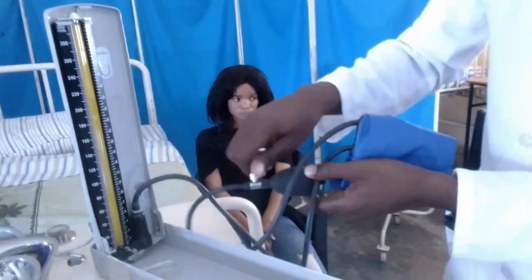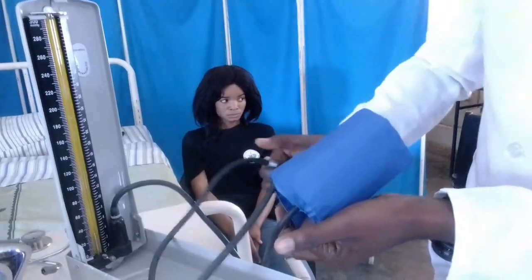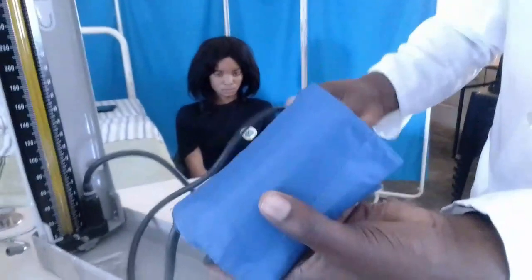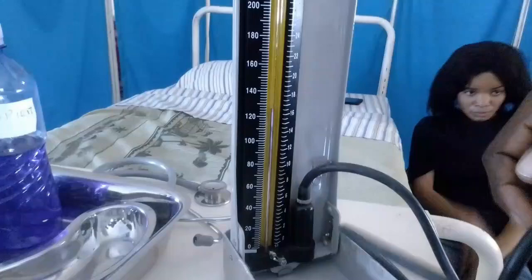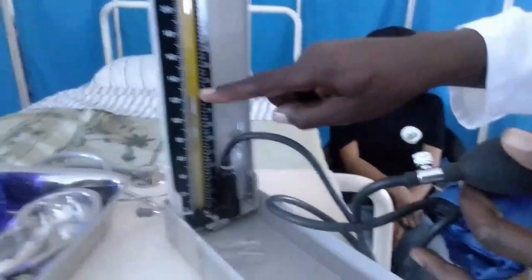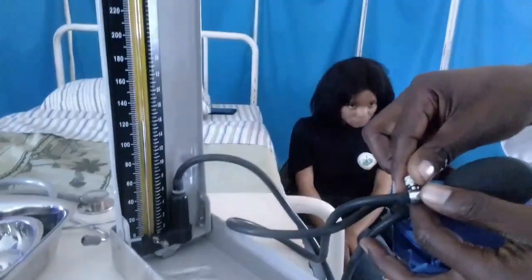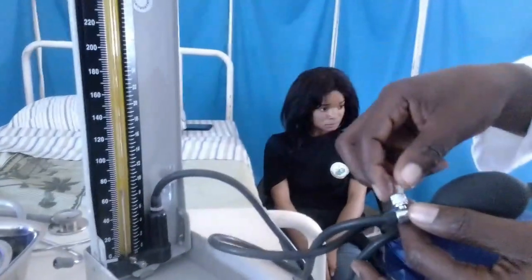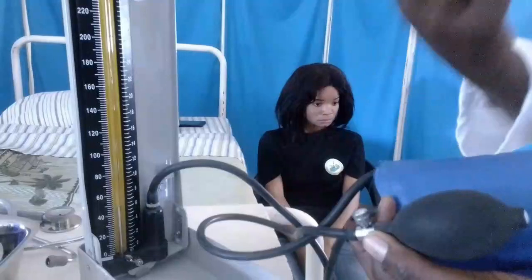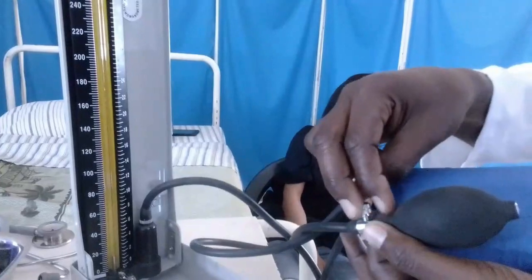Let's close again. We see, the cuff is also being pumped. This cuff, as you can see, is being pumped, then the mercury is rising. Then this has been closed. Now let's try to open slowly and see what happens to the mercury. Let's open the knob. You see, the mercury is going down, meaning this is open, and you can hear something like shh, that's air coming out. So that's what we do.